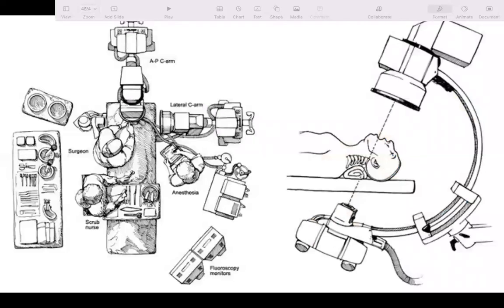The recommended OT arrangement uses two C-arms: one from the head end in a lordotic position to visualize the C1-C2 joint and odontoid through an open mouth view, and one from the side for a lateral view of the C1-C2 joint. Using a single C-arm is still doable, but two C-arms is recommended.